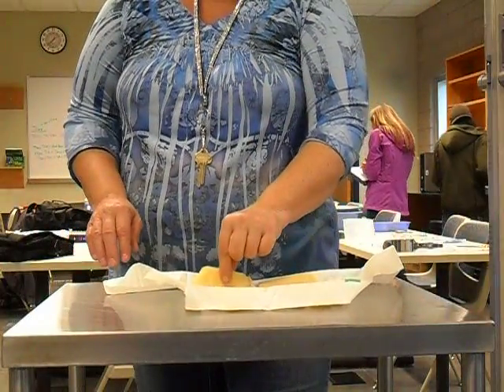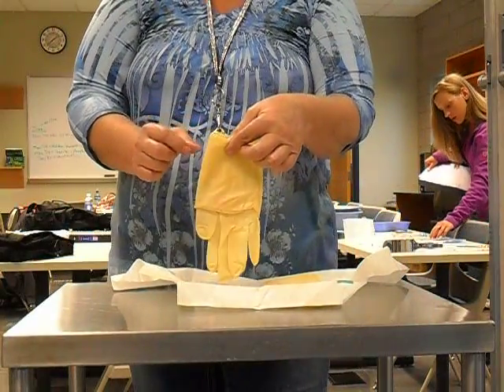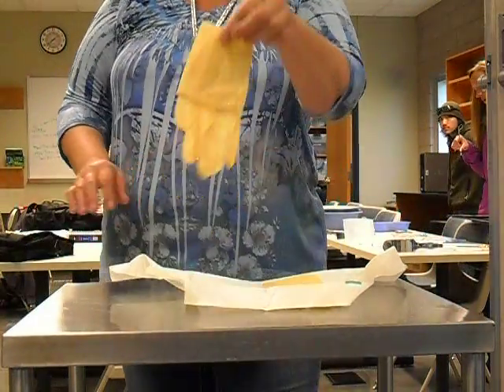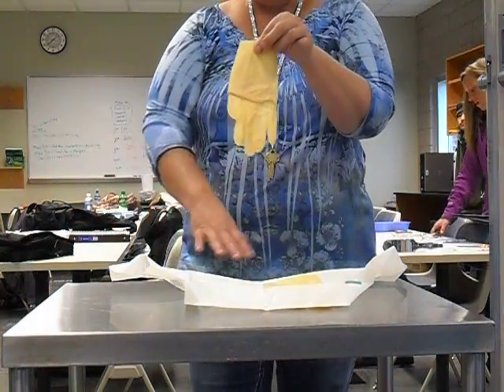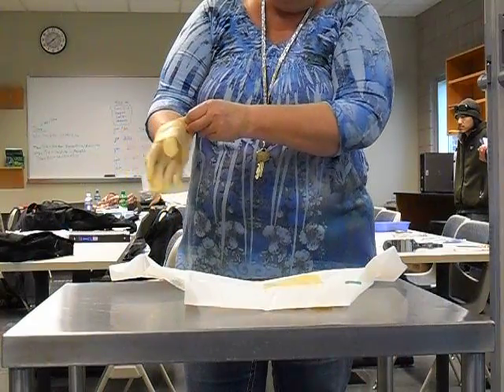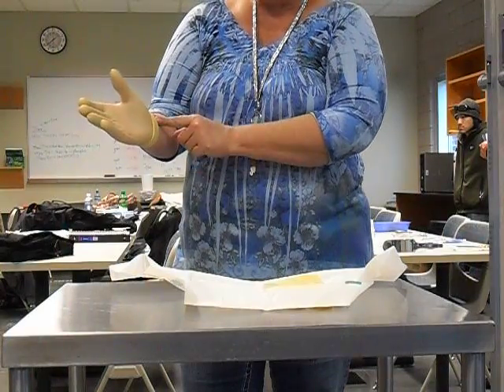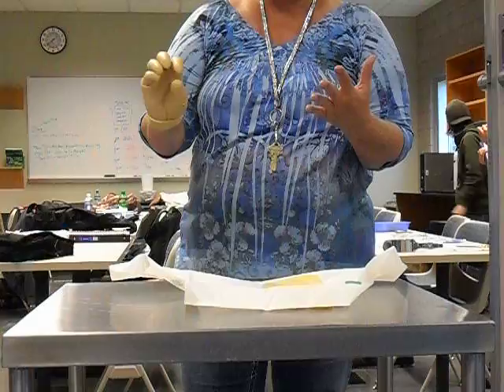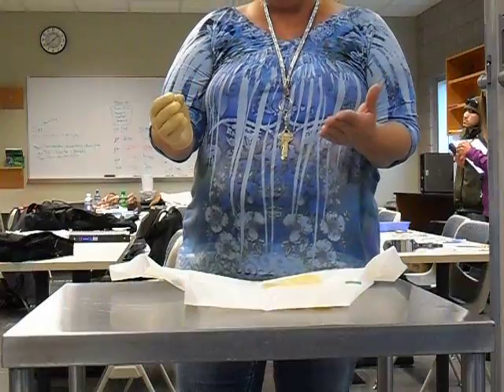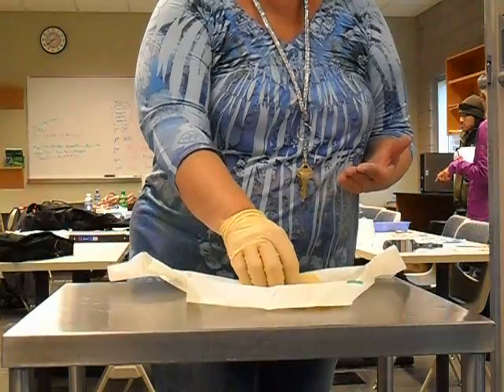So you want to pick the glove straight up, and I like to pick it up from inside one of the layers instead of both layers like you would do for closed gloving. So I'm going to pick the glove straight up, get it away from anything unsterile, and slide your hand in. Now you're going to notice that it's going to roll down on my wrist. So this has rolled and it's contaminated. That's okay, because whatever I'm going to be doing, I'm going to be using my fingers, so prepping or putting in a catheter.